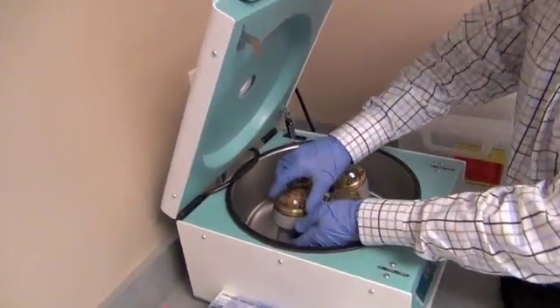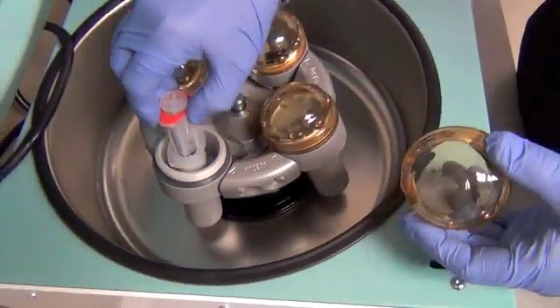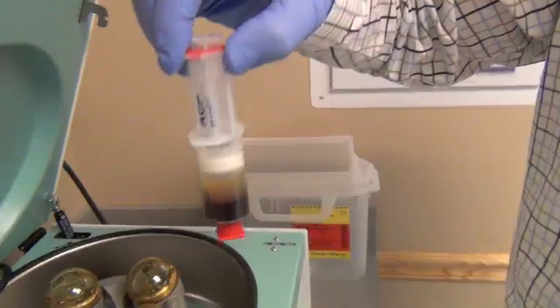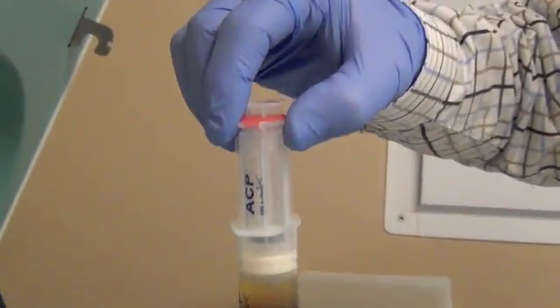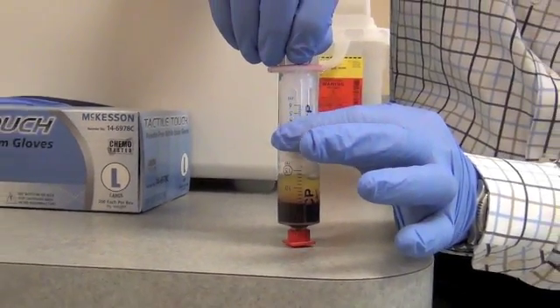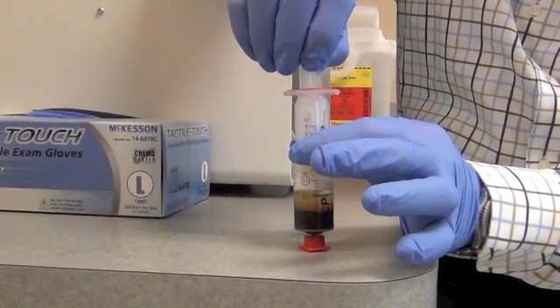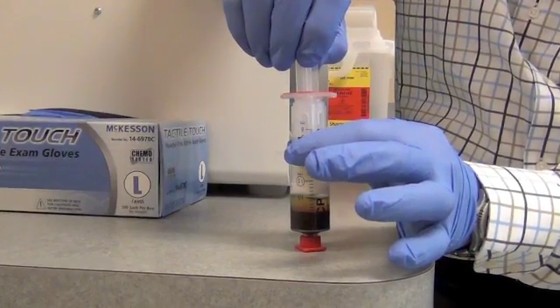Once this five minutes is completed, you will see how they are layered out. The yellowish layer at the top is the platelet layer — that's the plasma. Now through the inner syringe we will draw up the yellow platelet layer so that they are separated from the regular blood.